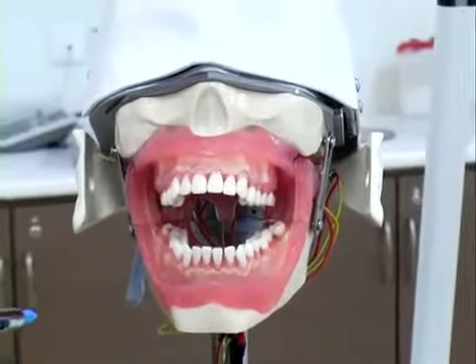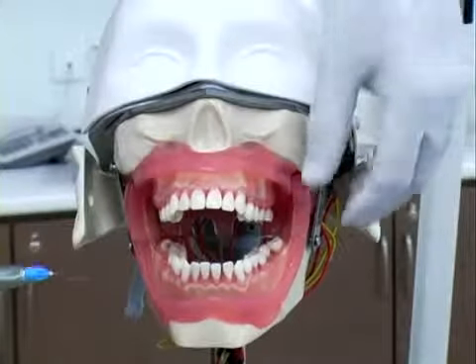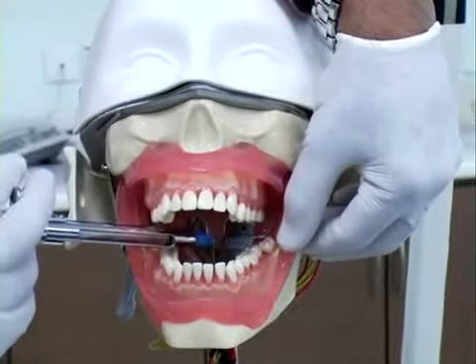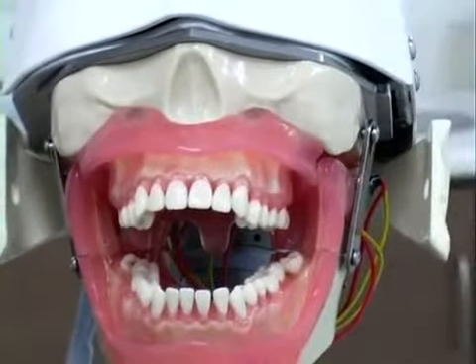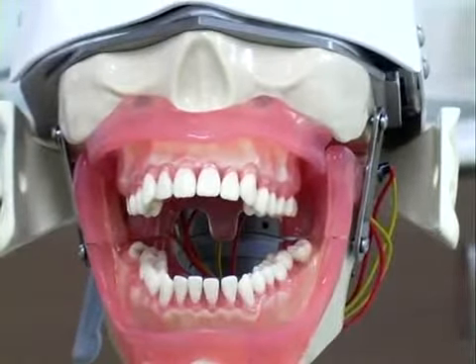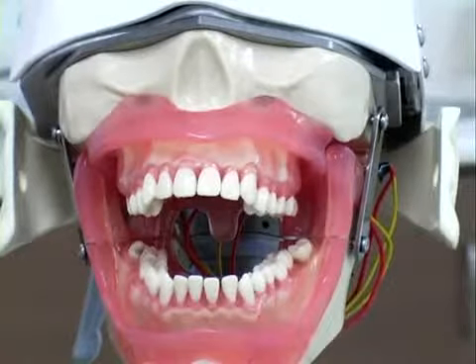We are also going to demonstrate the block of the lingual nerve, which is slightly medial to the lower wisdom tooth. By depositing a few mils of the local anesthesia in this area, you can easily block the lingual nerve.